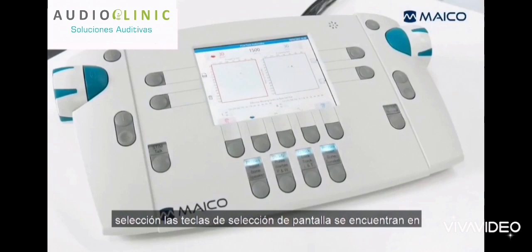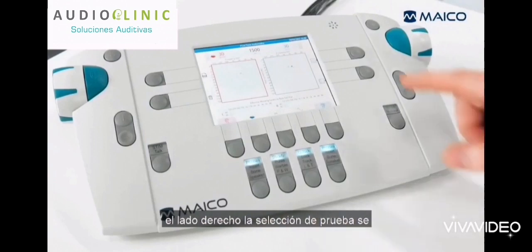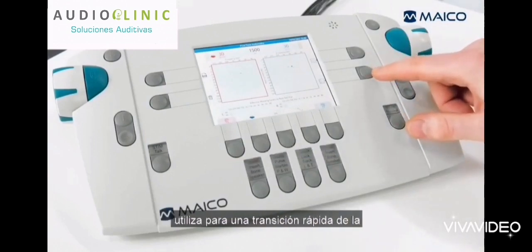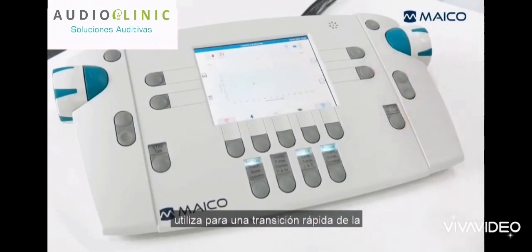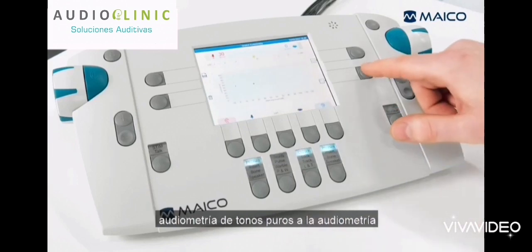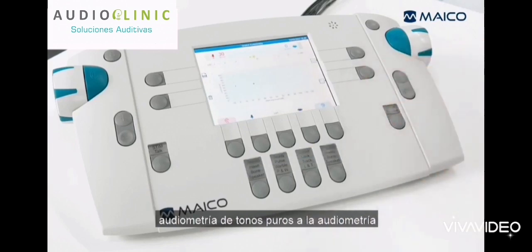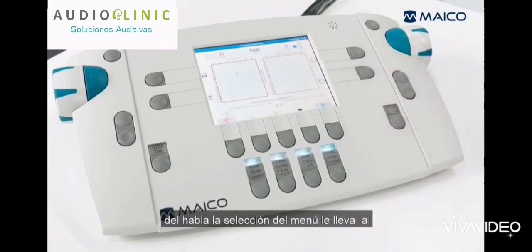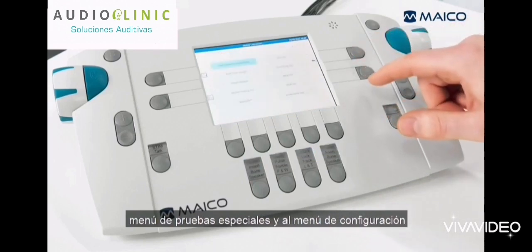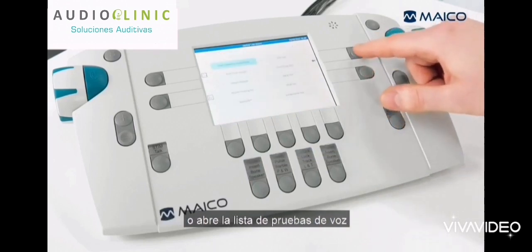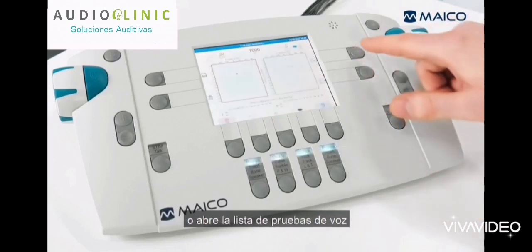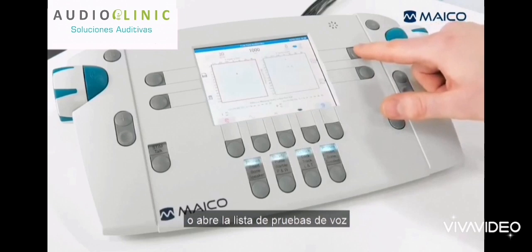The screen selection keys are located on the right side. The test selection is used for quick transition from pure tone audiometry to speech audiometry. The menu selection takes you to the special test menu and the settings menu, or opens the speech test list.